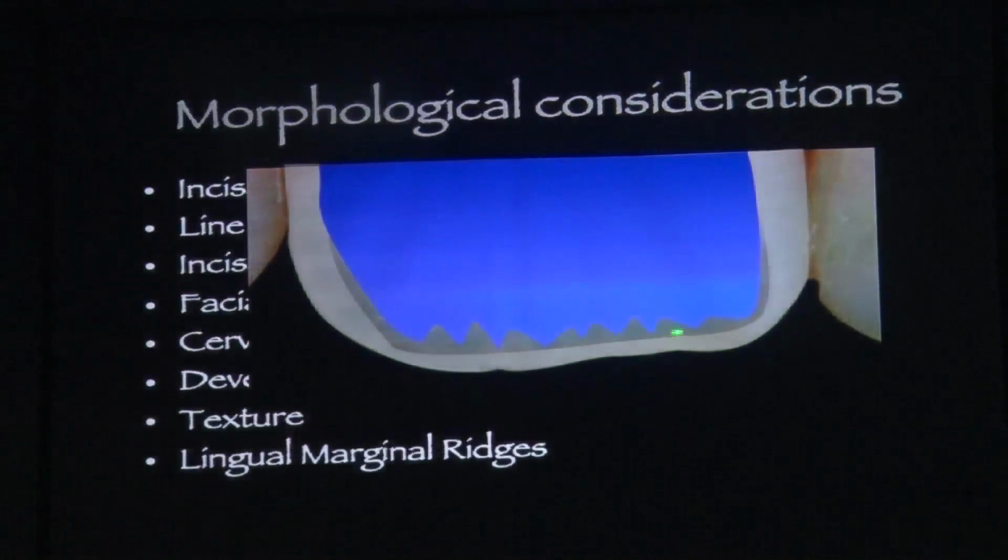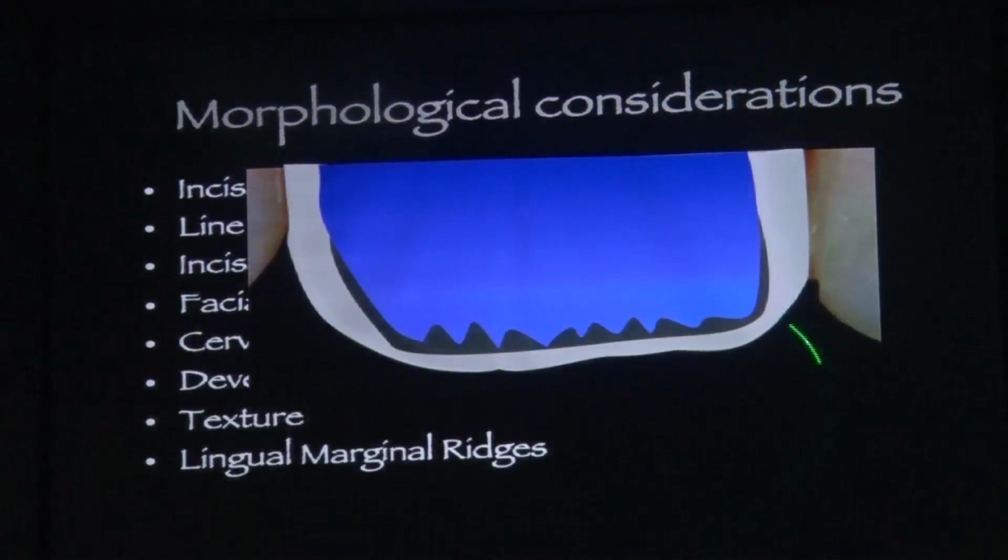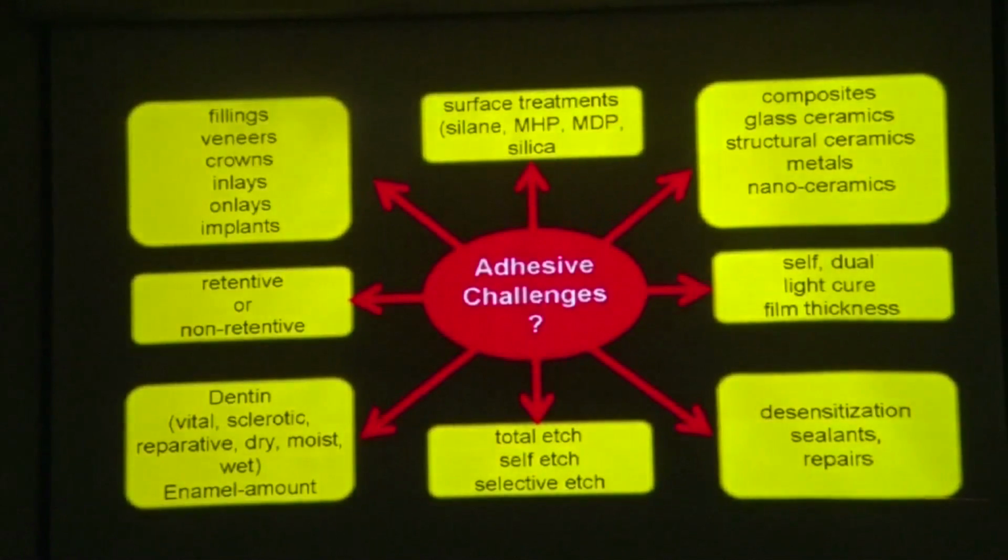Right? So if you have a young female patient aged between 12 and 20 years, they always have type 1 incisal translucency patterns, as I mentioned, and they always penetrate into the dentine like this. So that's why when you're working on a young female patient, always make sure your dentine layer is erratic like this. The most common mistake when we layer composite is we are too flat. Right? Never do that. The dentine shade has to be irregular and erratic. Make our job much easier.